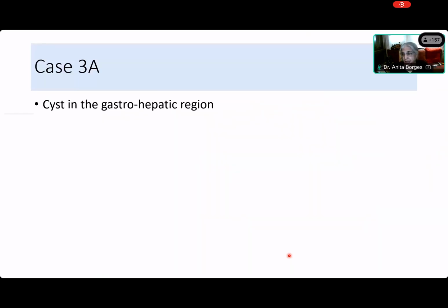All right, good. Who wants to take 3A? Who's next now? Does Aditi want to take this? Come on, Aditi. Is Aditi there? Oh, she's dropped out. Maybe she's dropped out. Okay, Diksha, are you there? Hi, Diksha, are you there? Yes, ma'am. Come on then. Ma'am, cyst in the gastrohepatic region. Yes, very good. Come on, say something about this, Diksha.